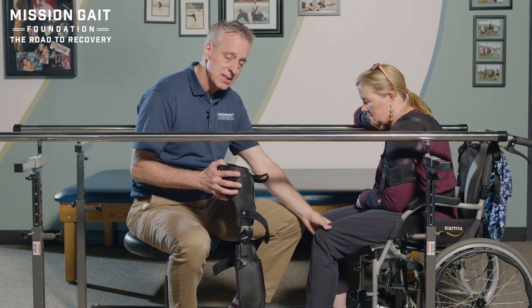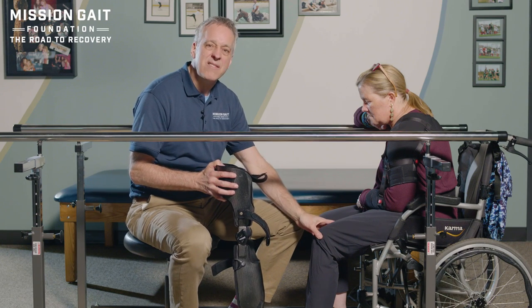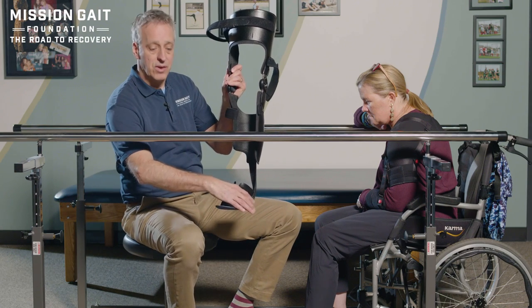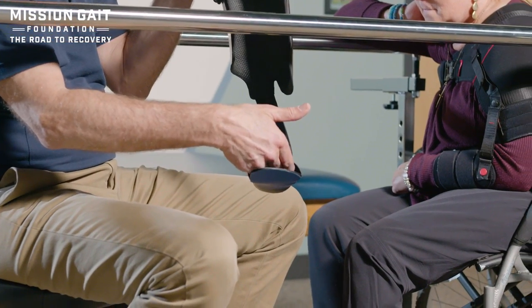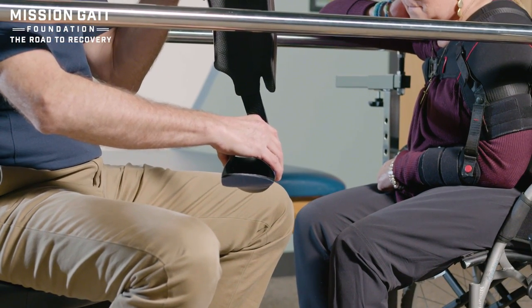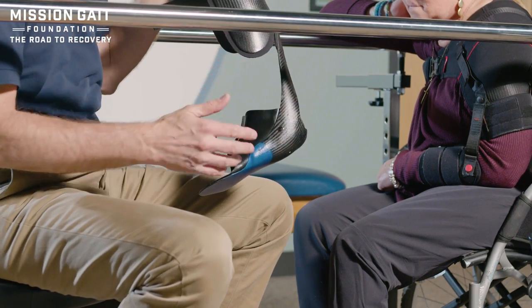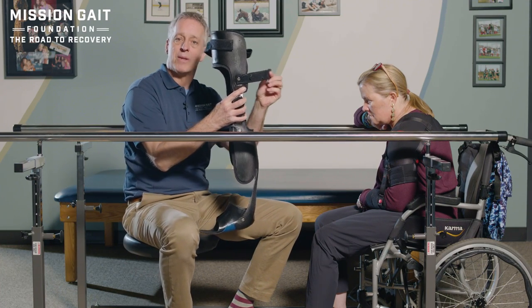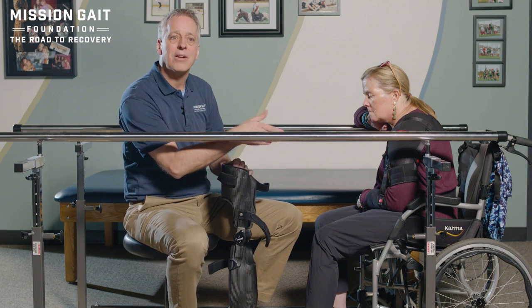In this particular case, as with some of our patients needing KFOs, we have a hyperextension tone issue and a varus, or an inverted ankle, inversion problem. You'll see a boot around the foot plate which gives some support, wraps around the ankle for stabilization and control. There's also a posterior leaf spring that has good energy return but bends fairly easily, so we're not forcing too much hyperextension. The brace at the knee with this posterior strap — the money strap, I like to call it — will keep that knee from going into hyperextension. She can use that tone to her benefit, and then release it when she comes out of stance phase into swing.